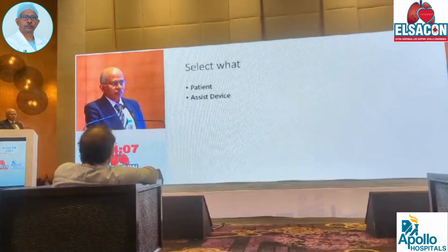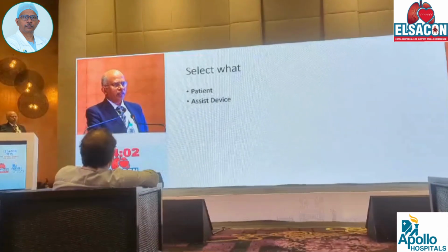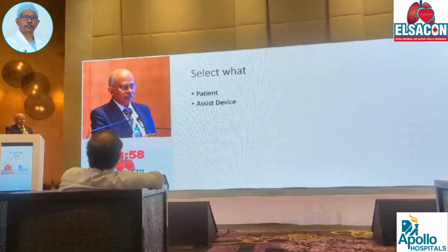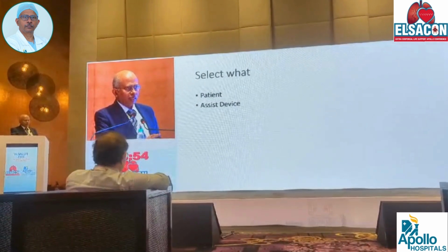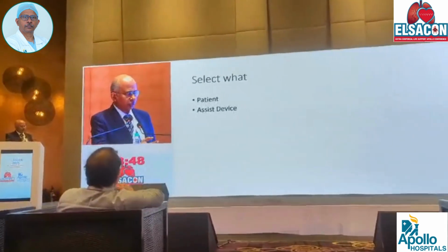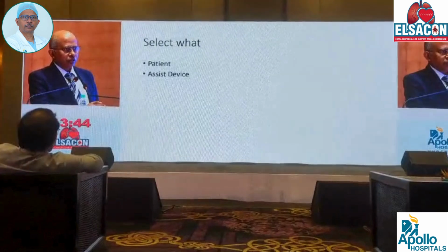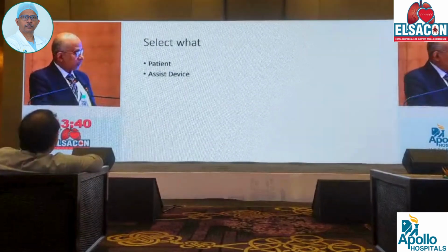Okay, so we will talk about both of them, a little bit of it. If we go straight forward with selecting the patient, we know it is very simple, because whenever we have a patient who is not responding to the standard treatments like the inotropes, and is getting escalated on inotropes, we naturally should consider any of the devices, as has been discussed in the previous talk.